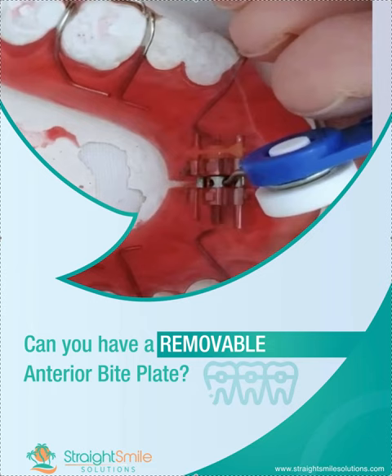Hey, it's Dr. Amanda with Straight Smile Solutions, straightsmilesolutions.com. The question today is: can you have a removable anterior bite plate? I know you're thinking this is not an anterior bite plate — it is a Schwartz — but it is also an anterior bite plate. There is stacked acrylic in the anterior section.